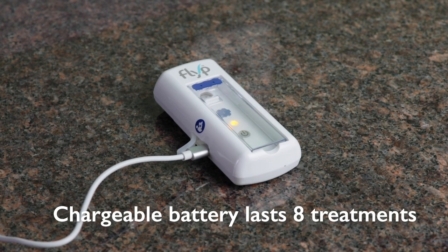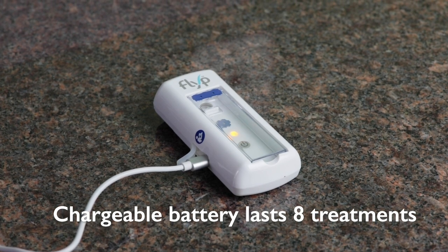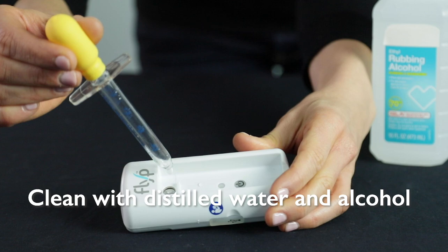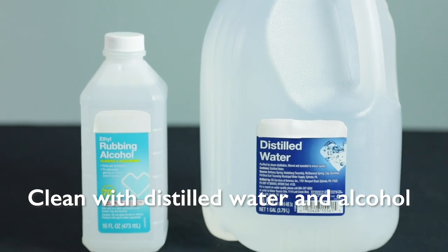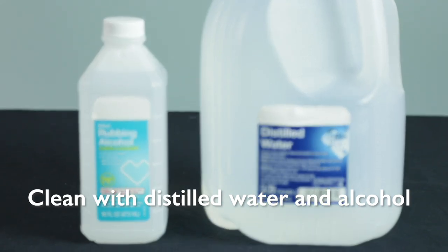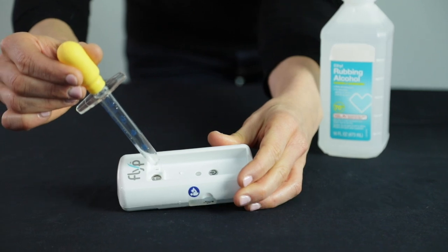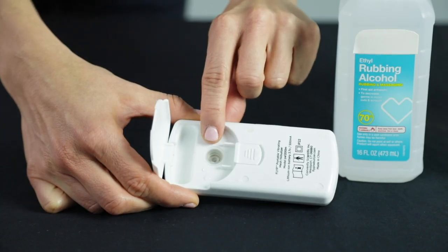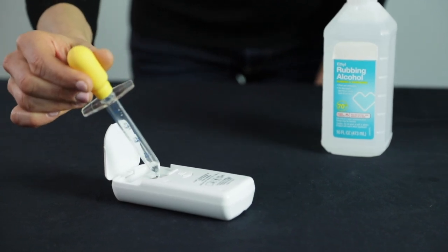The Flip has a chargeable lithium battery that will last eight treatments per charge. Cleaning of the Flip is slightly different — the manual suggests using distilled water for cleaning. It also recommends using ethyl alcohol for disinfecting instead of boiling water, because the nebulizer disc is not removable from the battery unit.